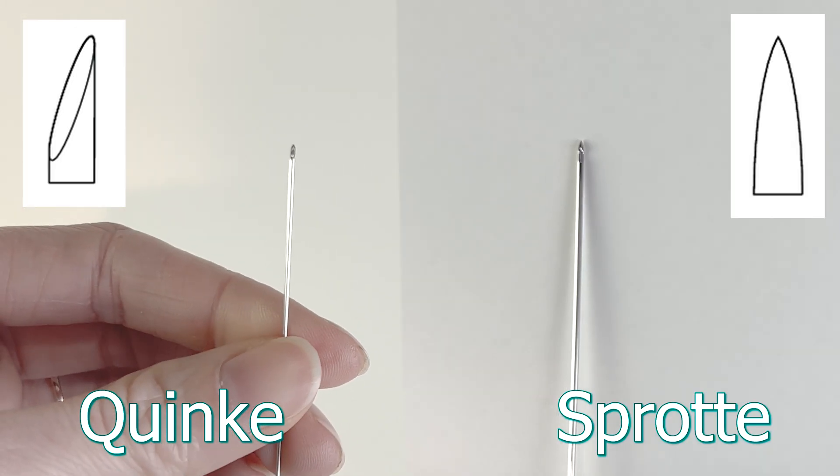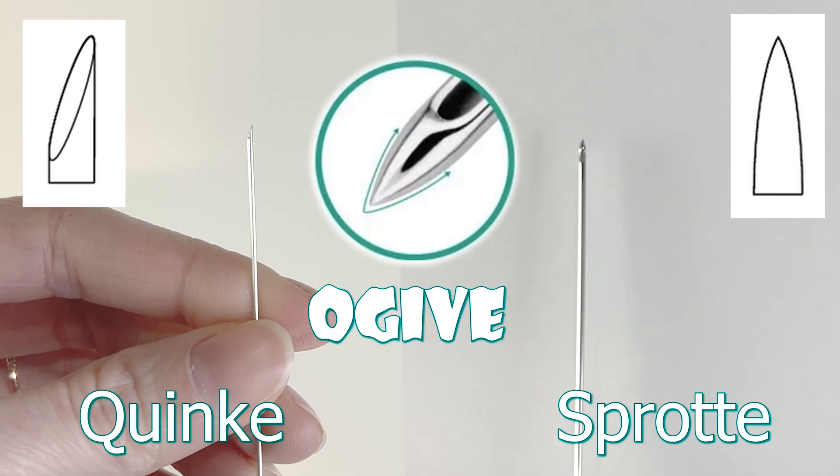Unlike the sharp tip of a Quinke needle, the Sprott needle has an ojive shape, which is considered atraumatic.